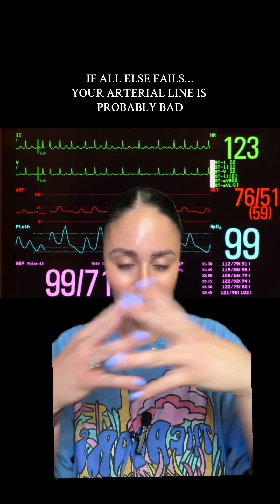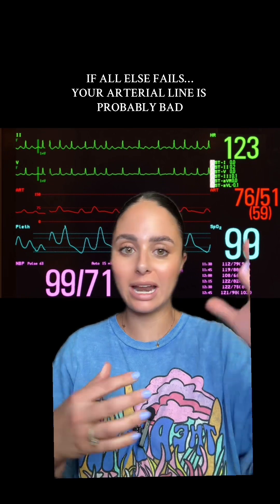If you've done all those things and you're still not getting a good waveform or accurate blood pressure reading, you might just have a bad arterial line. They go bad, especially if they've been in for a while or your patient's moving a lot, so you may need to ask the provider if they would like it removed and exchanged. Those are my troubleshooting tips — let me know if you have any questions.